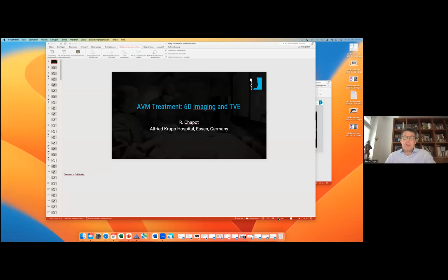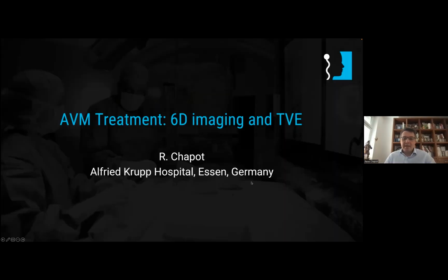So thank you for your invitation. I'm happy to share some thoughts on the way to proceed, which is very close to what Charbel just presented to you. The idea is to go on from transvenous embolization, and the key point in what we do is to understand, and Charbel showed you very nice images.